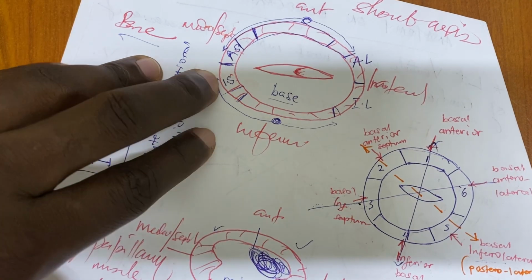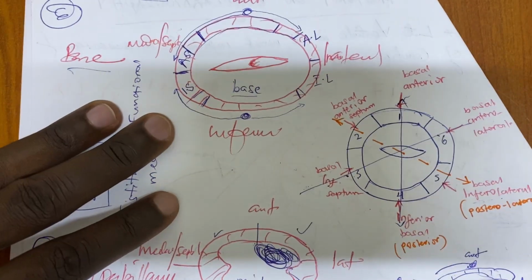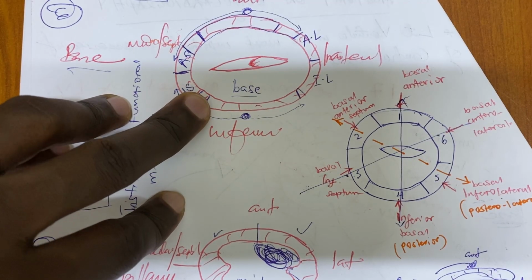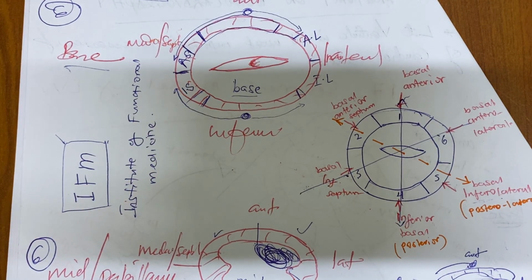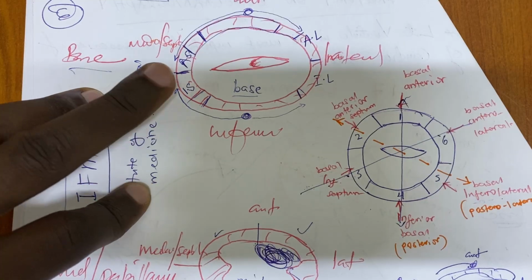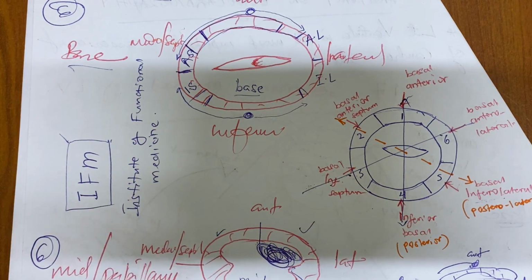Here, when I'm taking this one, I see contractility at the base. From the cardiac anatomy and function and the mechanics, we know the base is not all that mobile. It moves less because of the annulus. There is a ring there in the anatomy of the heart. There is a ring which separates the atria from ventricles. There is a fibrous ring there. And the muscle mass there is not much. So this one is not always moving so fast or so much as compared to from mid to apex.